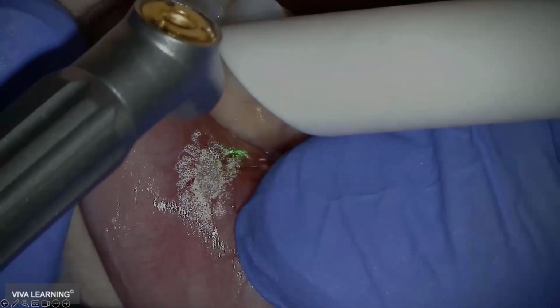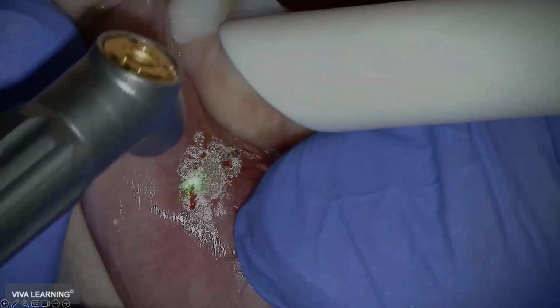But you see where it's really just hitting that top level surface. And that's the thing about the lasers. You can do one cell layer at a time, or you can bomb through enamel for a class 2. Both are all based on how you're using your foot pedal, right?